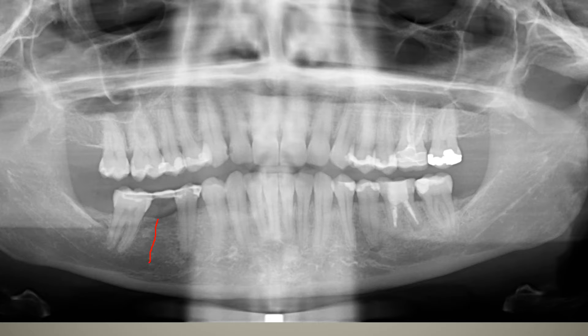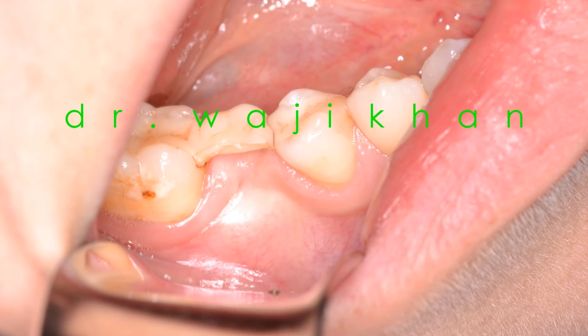In this photograph you can see from the panorex that there is adequate bone height in the 4-6 region. The root form is adequate, there is sufficient inter-arch clearance, and we are nowhere near the inferior alveolar nerve. However, when you look at the photograph you can see there is inadequate bone width. You don't need a CT scan here to determine that the width is going to be inadequate.